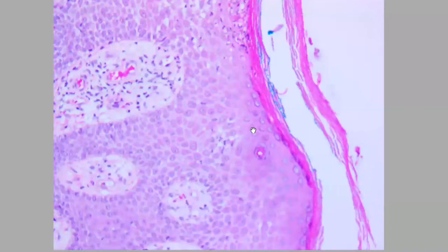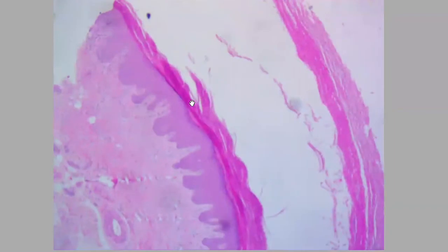I will show you another slide with more recently diagnosed psoriasis, because as we mentioned, the features will depend upon the stage of the disease. So this slide is for another patient recently diagnosed with psoriasis. And here we can see the overlying corneal layer. They are still having this basket weave keratin, indicating the recent onset of the disease. And again, here, these are the test tubes as if sitting or standing in a rack. So they are maybe more evident in this case. And maybe we can go on higher power just to make sure that this is psoriasis. We need to see some key features.